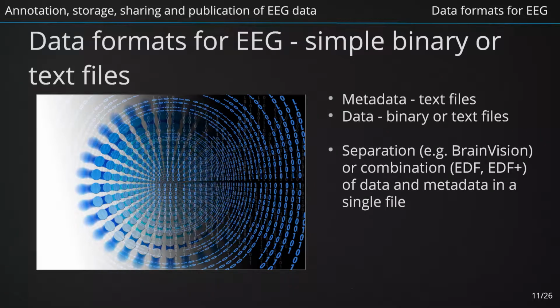A typical example is the already presented Brain Vision format that strictly separates data file from metadata files. On the other hand, another file-based and widespread format, EDF and EDF+, combines data and metadata in a single file. On the following slides, we present a representative selection of these formats.